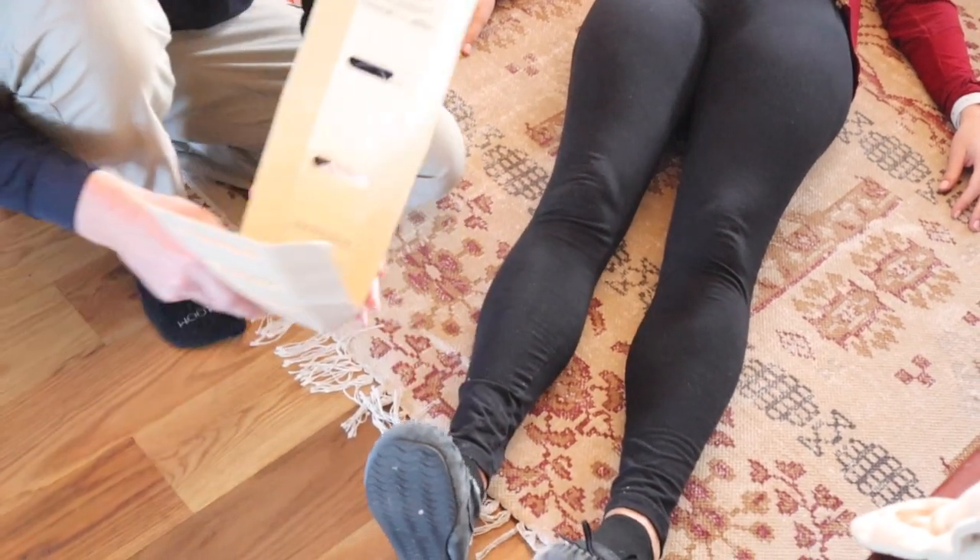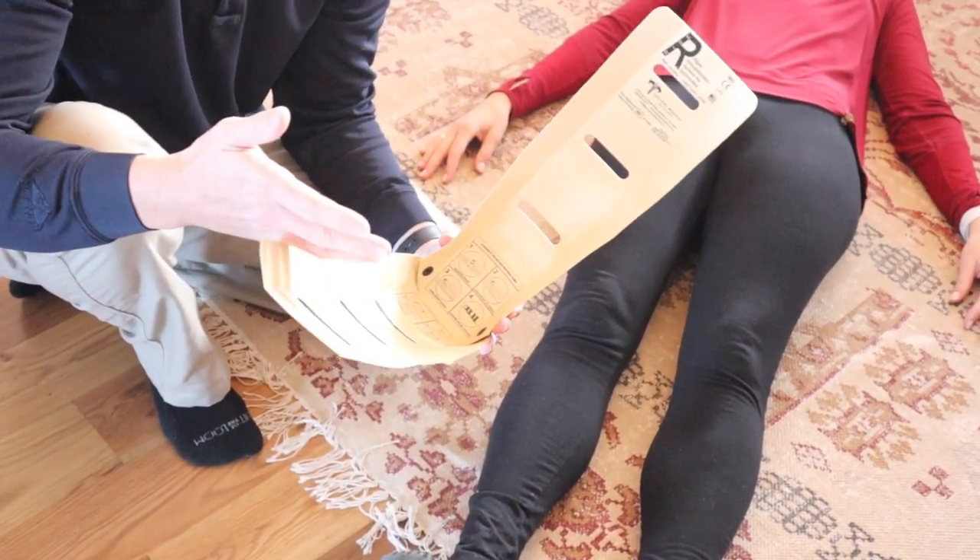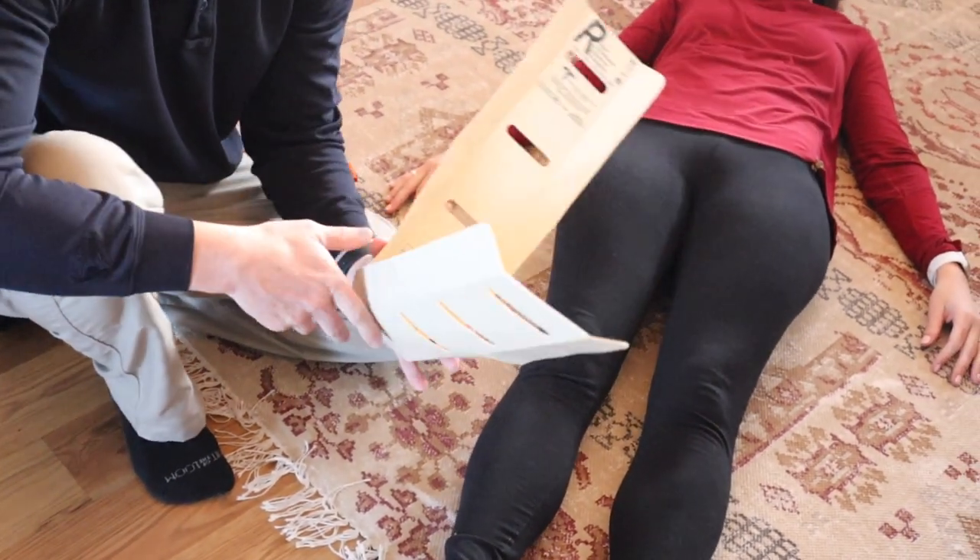This operates just like your typical splint does. And because it's not cardboard, if you get some blood on it, it's going to wipe clean — you don't have to worry about contamination.